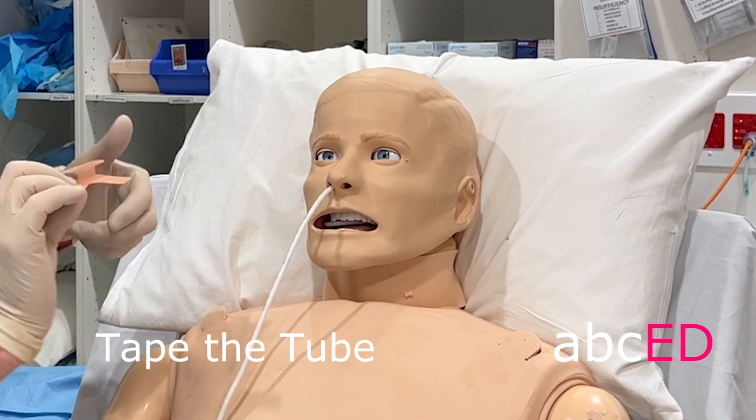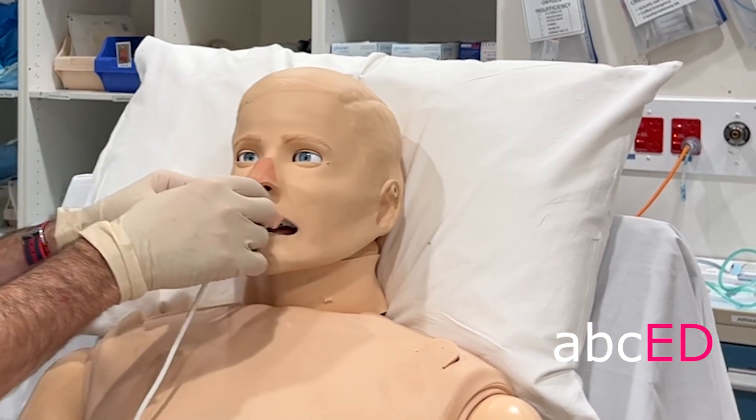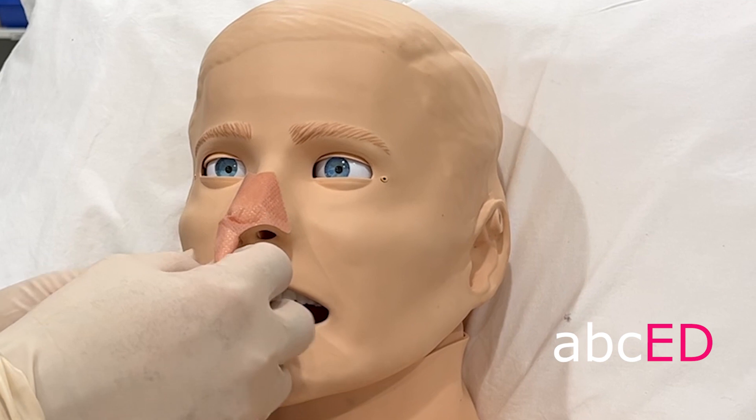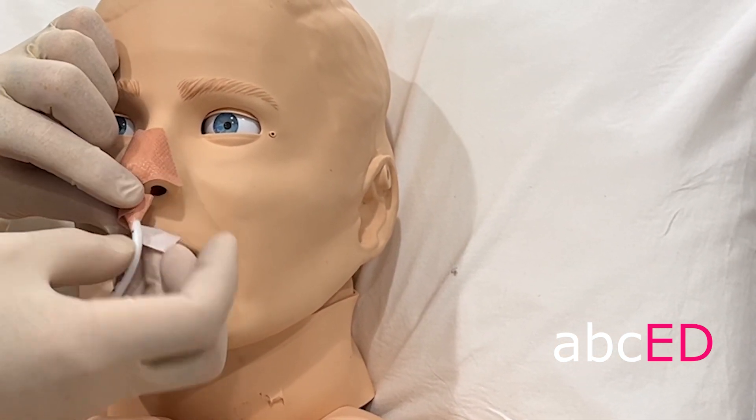We've got these connectors — you peel off the ends and apply them around the tube, and that will keep it nice and secure.